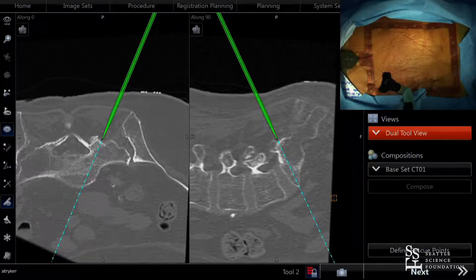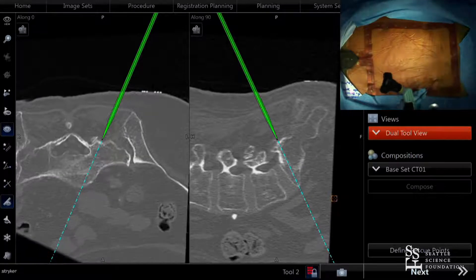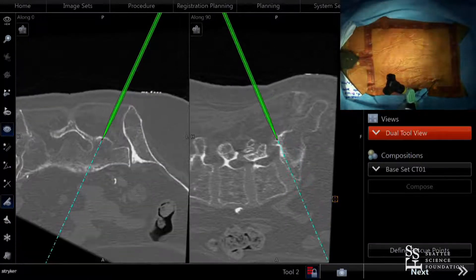The nice thing about navigation is we can really see our medialization, our starting point, and verify that we're not violating the facet joint. That looks like a pretty reasonable point — we're aiming toward the front of the sacrum, not violating the facet joint or the spinal canal. I'll go ahead and start tapping the Jamshidi.